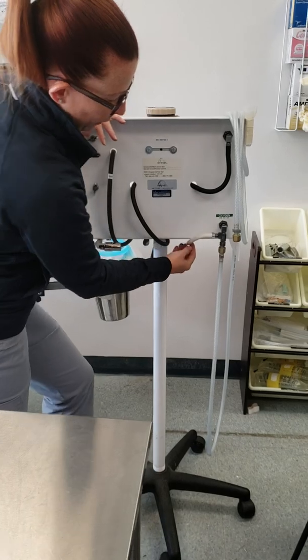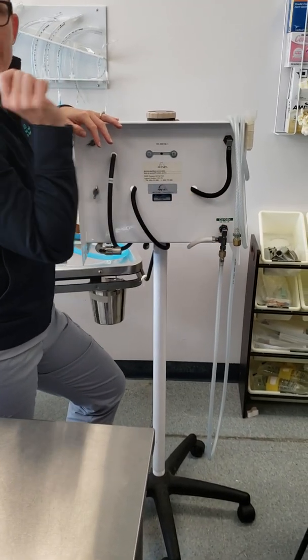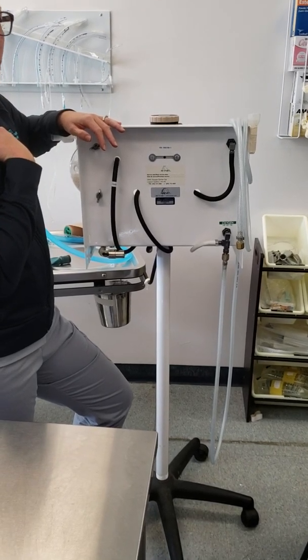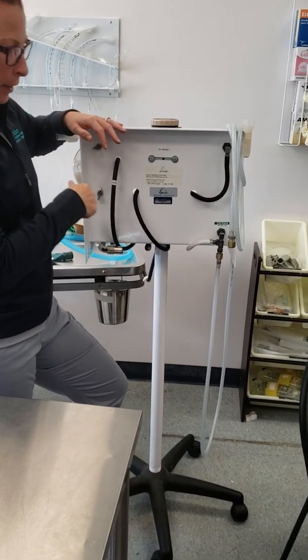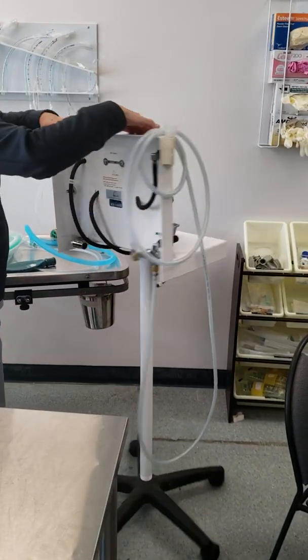This tube here is what attaches to our oxygen flush. That's why we never press that oxygen flush button when our breathing circuit's still attached to our patient, right? Because now we're flushing a huge pressure of air through their lungs to fill our bag. Okay? So from here, it comes in through our flow meter, which is here.